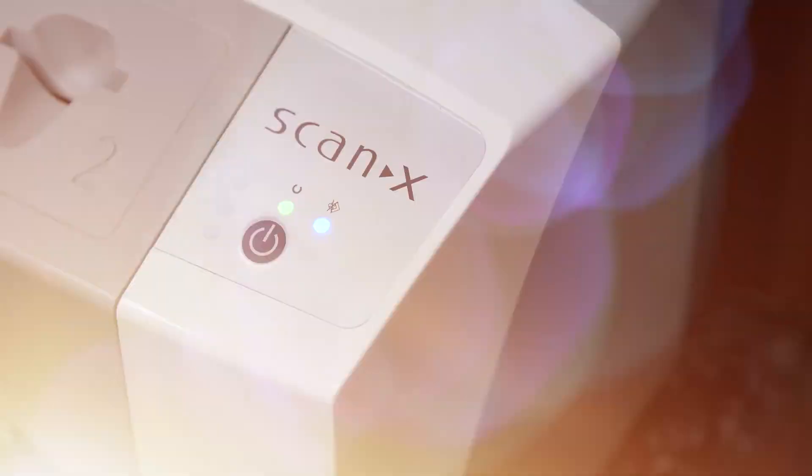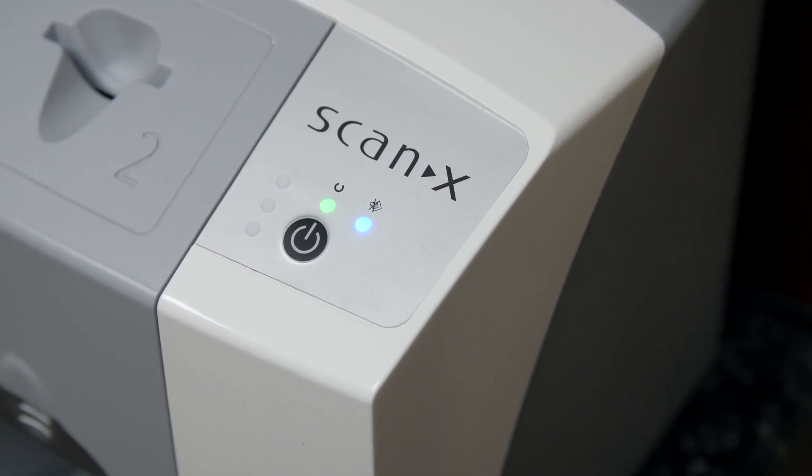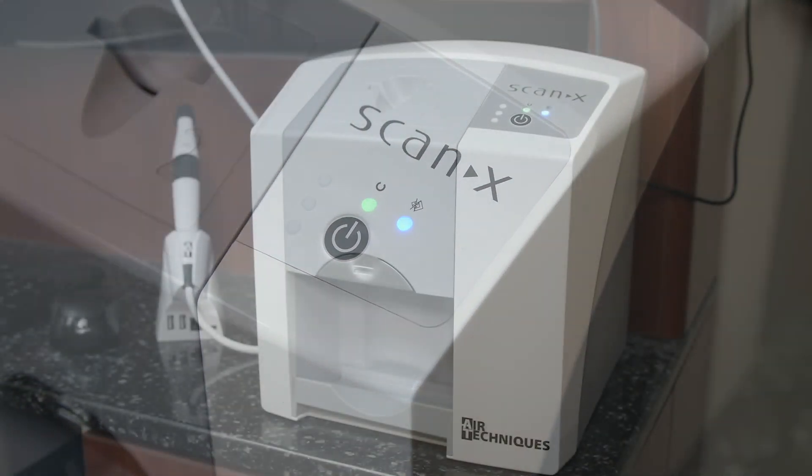Traditionally, some of the issues with imaging systems have been that they're cumbersome, time-intensive, and difficult to integrate with normal workflow, making it a challenge for case acceptance. ScanX by Air Techniques was a solution we turned to to solve all of our needs.